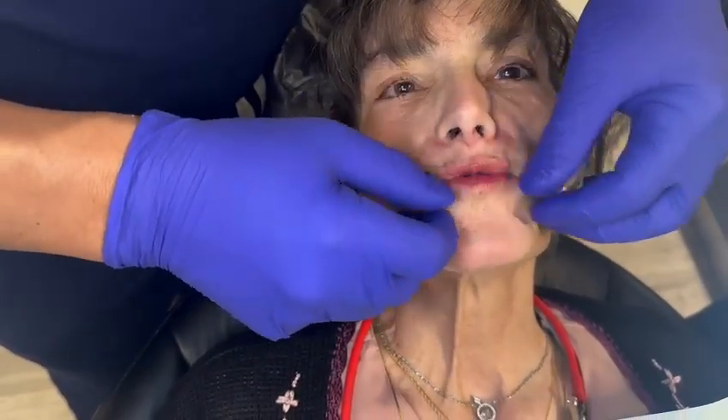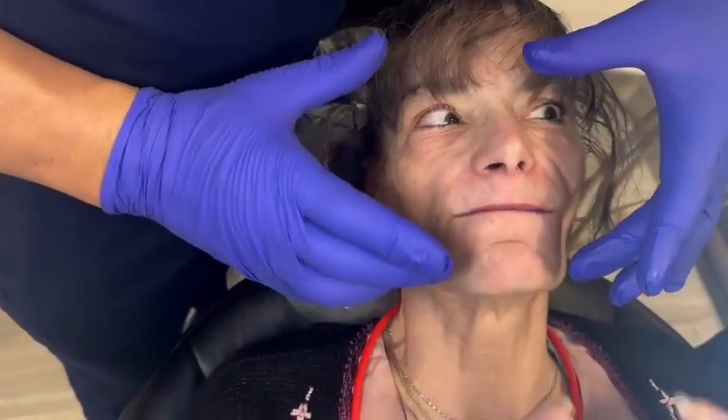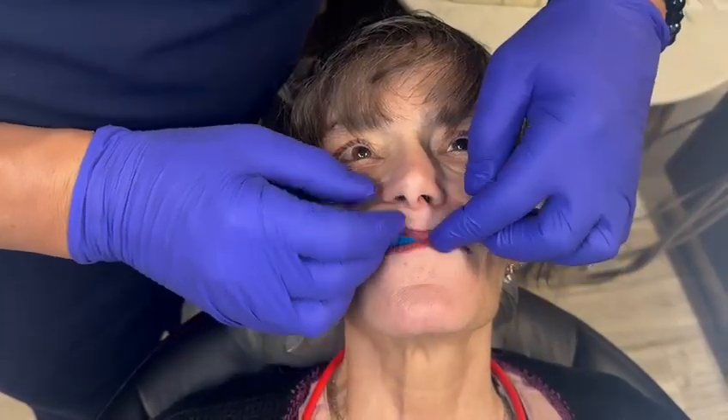Can you get your lips closed comfortably? Can you see the lower third of her face pretty good? So we've got a working vertical. We've restored the lower third of the face.